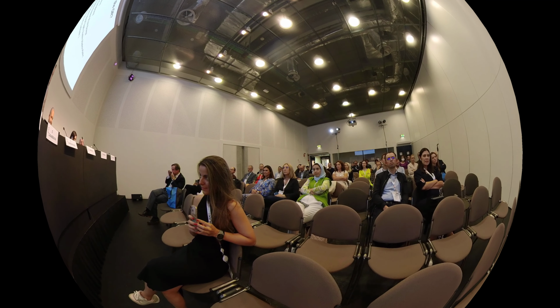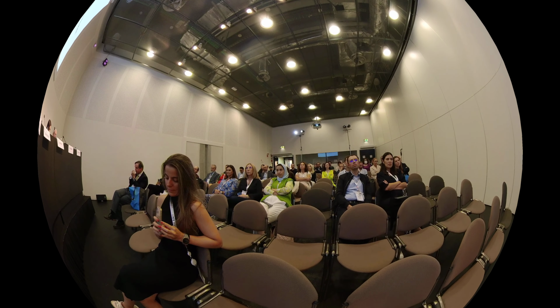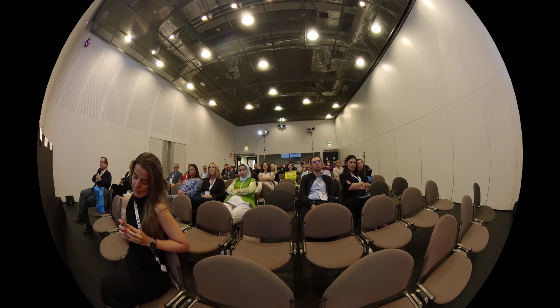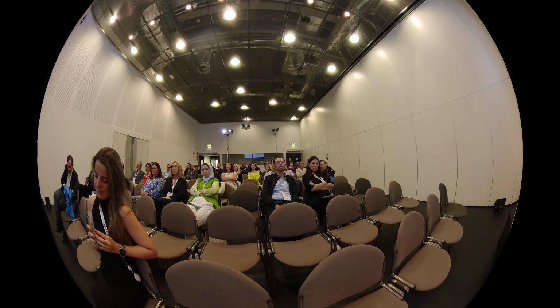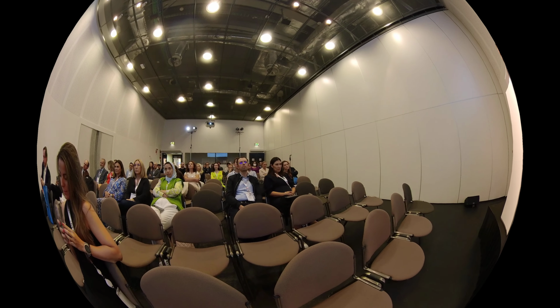If you have access to a 3-piece IOL and a 27-gauge needle or whatever, you will learn how to fix this lens with the scleral technique, or with the glued IOL technique if you are going to do the glued IOL technique. Or if you have access to this novel lens, which I do believe is the future of the era of the scleral fixation techniques, you learn how to fix the new Carnevali lens.